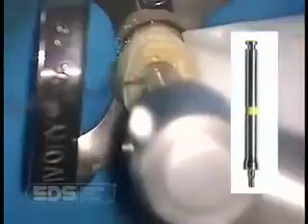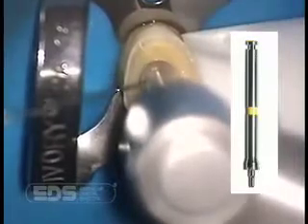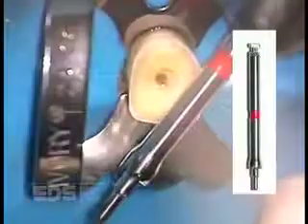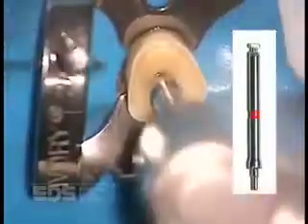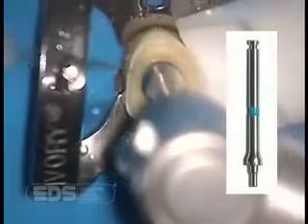We now use the countersink drills in sequence, starting off with the yellow countersink drill, always cutting wet. Next, we use the red countersink drill, and finally the blue countersink drill. The countersink drill makes the seat preparation for the flange and second tier of the Flexi-Flange post all in one operation.